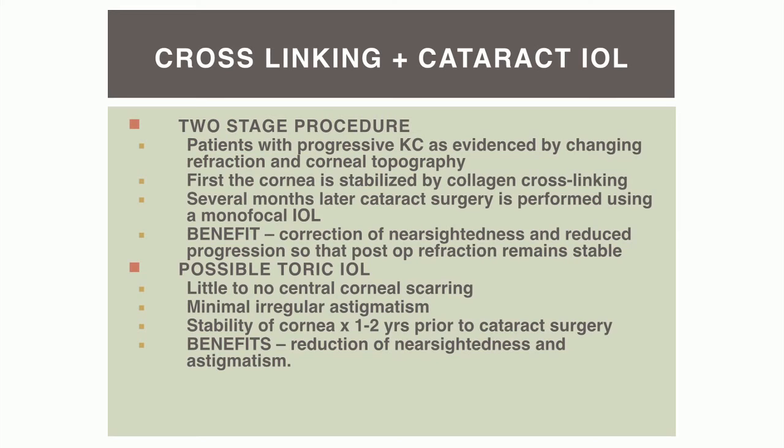initially after cataract surgery. And what about the possibility of putting a lens inside the eye where we could reduce the astigmatism?